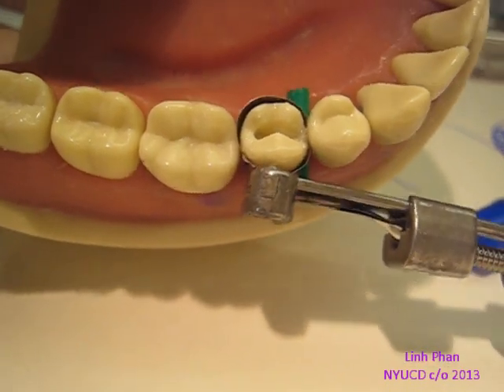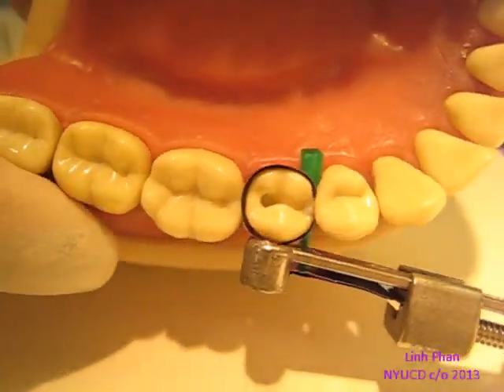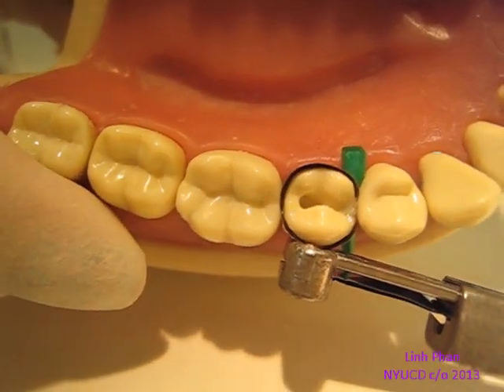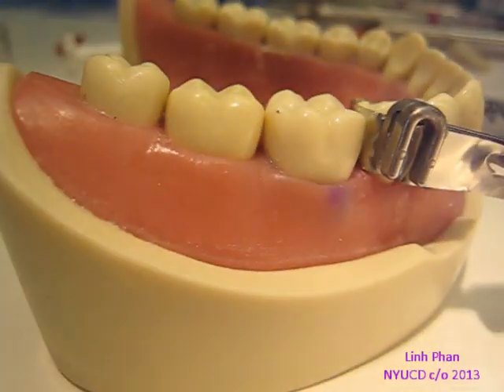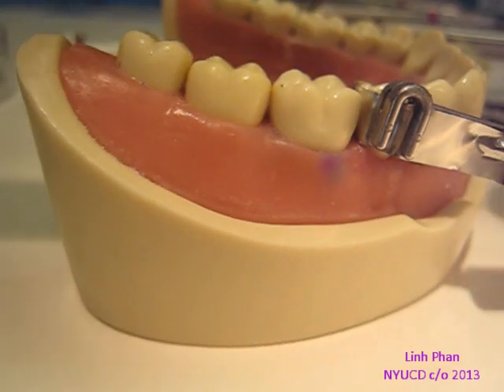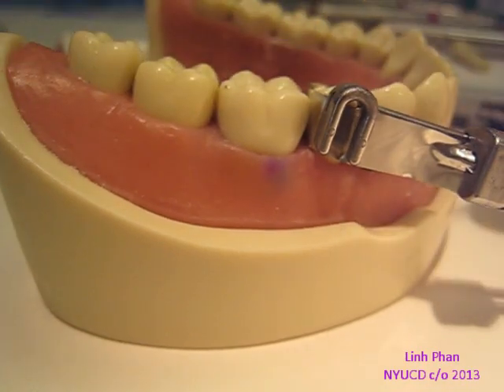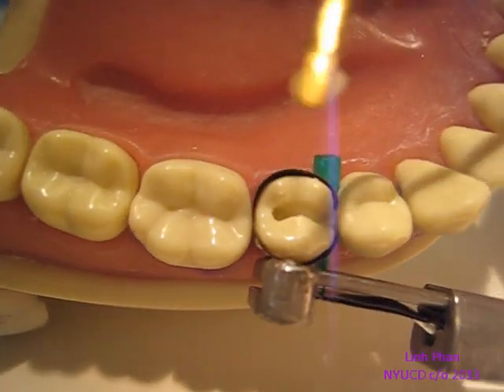I'm going to cure this. Let's go ahead and do the other lingual cusp. Add a little more bond, just a little, take a little more composite and we'll fill in the other cusp.